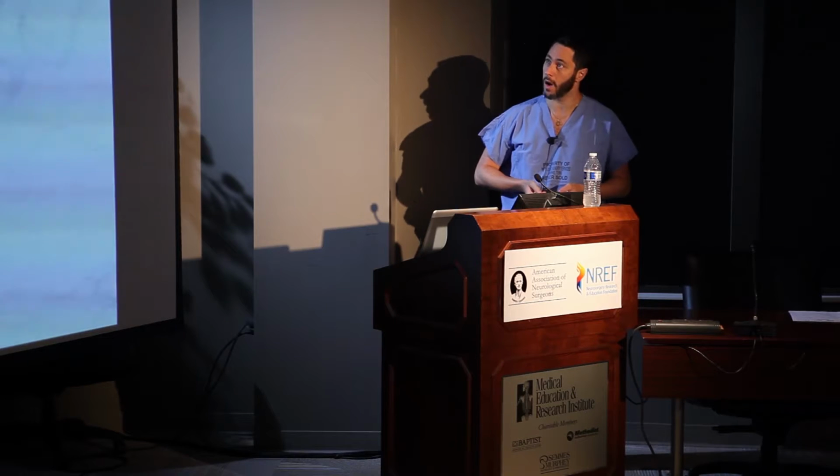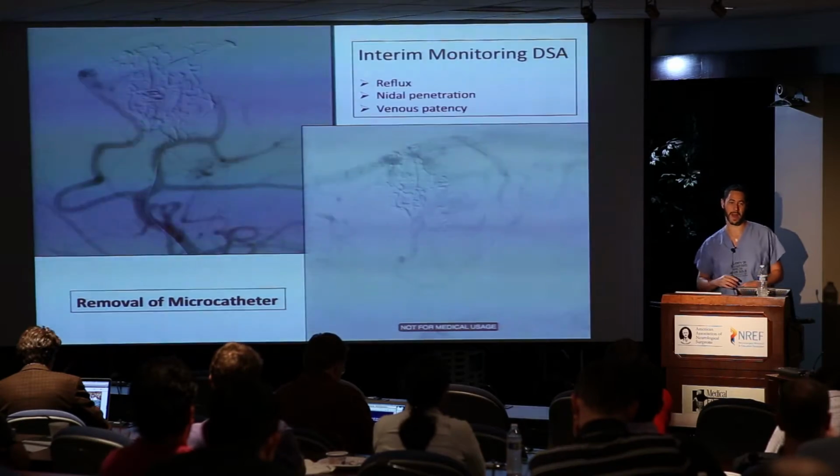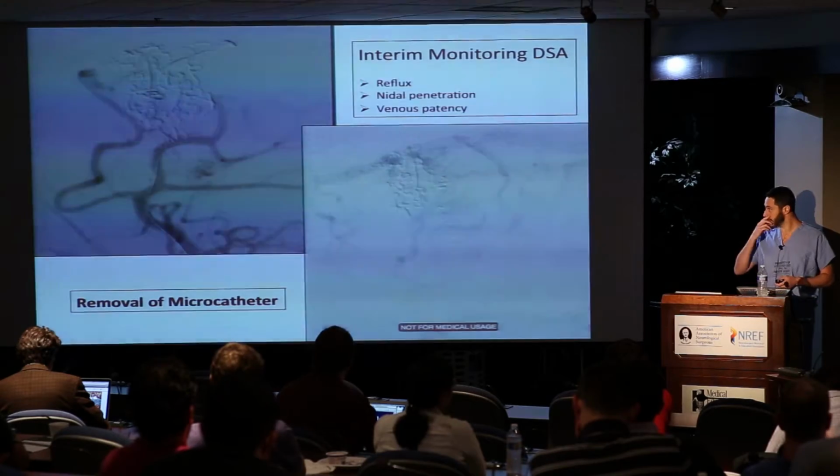Okay? And what's the limit of your embolization? You should have decided this before you started injecting. What's your maximum reflux? You need to get that catheter out at the end of the day. Okay? And so I'm going to show you some bad things that happened to me.